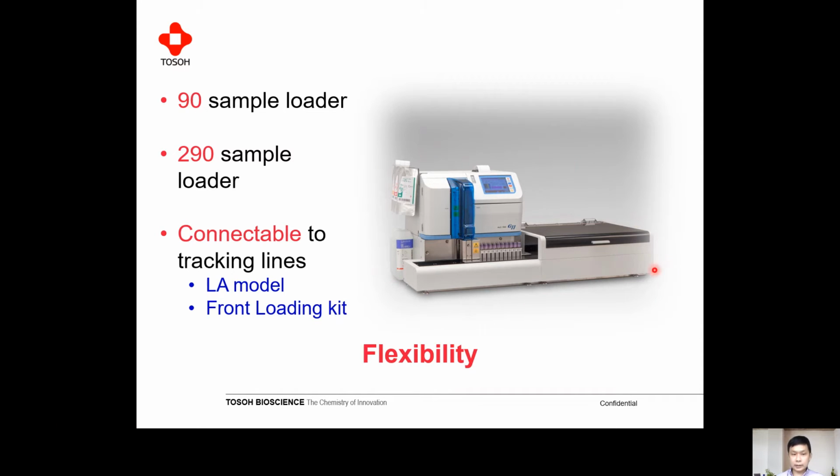And our system is connectable to the tracking lines, but you need the LA model, which is the lab automation model, as well as the front loading kit. So in terms of flexibility, we have different options to cater to different needs.